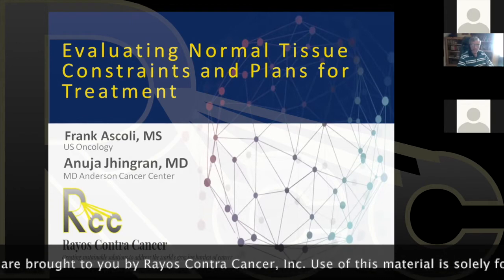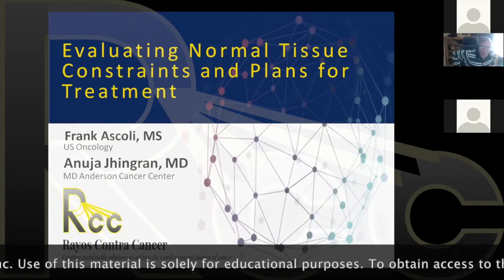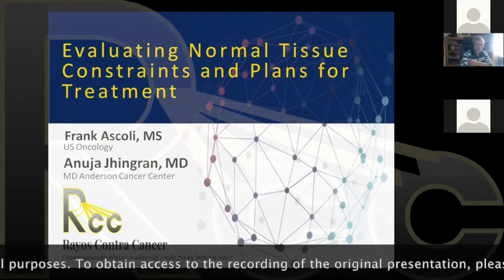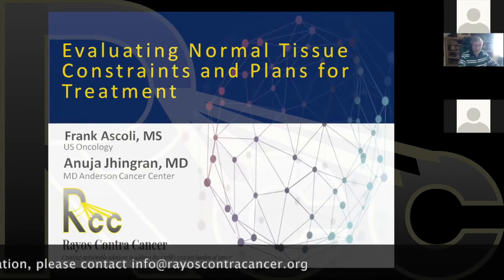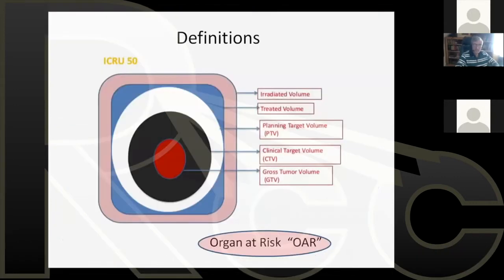Today's topic is going to be evaluating normal tissue constraints and plans for treatment. This is a very, very important part of treatment planning and will help make clinical decisions that will affect the outcome of the treatment to improve it and also to minimize the side effects.